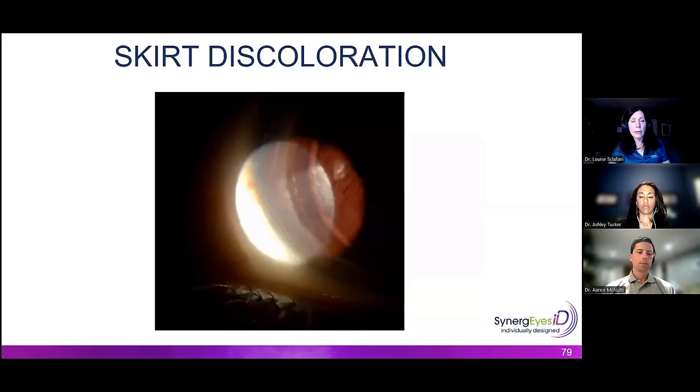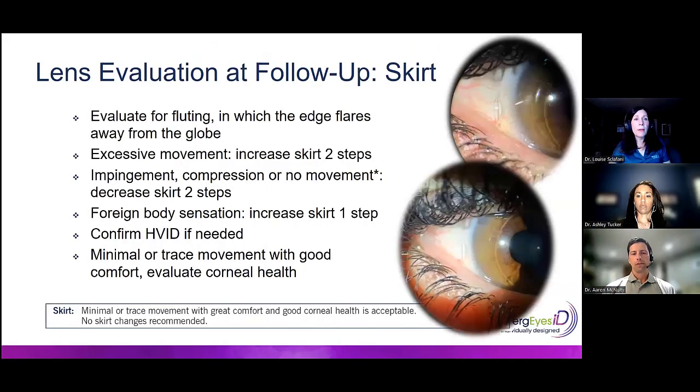If they're in a peroxide, switch them to a multi-purpose. If they're in a multi-purpose, switch them to a peroxide. But it typically doesn't cause problems, but the patient is aware of it. And then, we have to really look at that skirt.